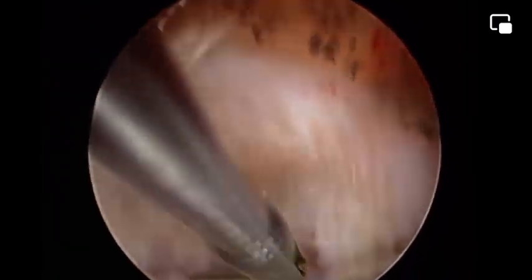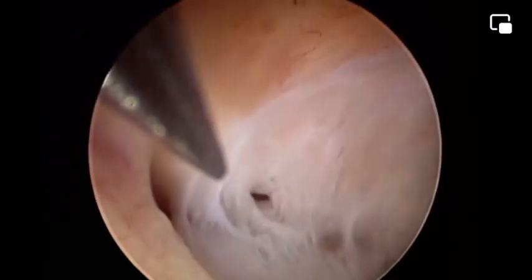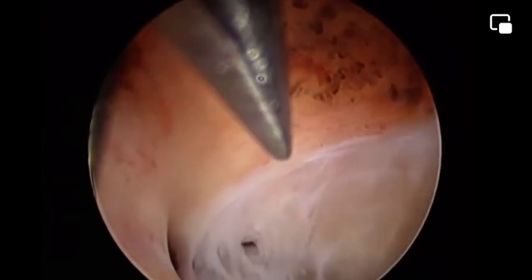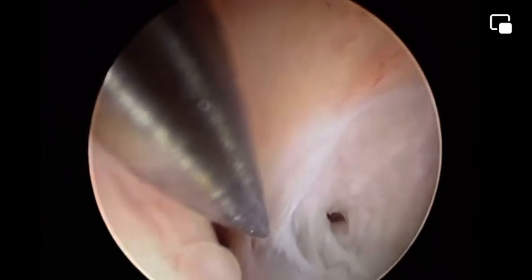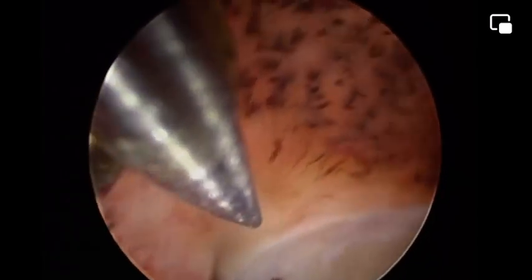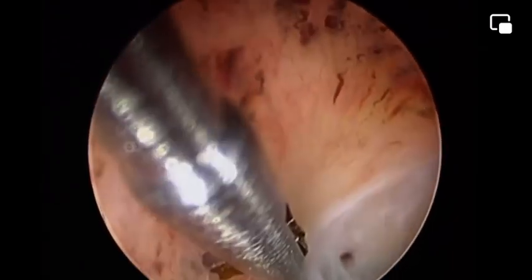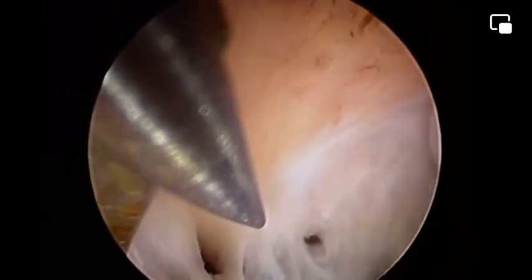I get amazed that in some training programs, they say certain rules like only move the scissors in and out. This is not actually practical. Sometimes you need to fix the scissor position and move the whole system. Like now, I'm fixing the scissors and moving the whole system in and out. Also, you have to train yourself how to rotate the scissors. And this is by the hand grip. You have to see it to know how to do it. Rotate the scissors to adjust the direction of the blades in the correct direction to cut the tissues.